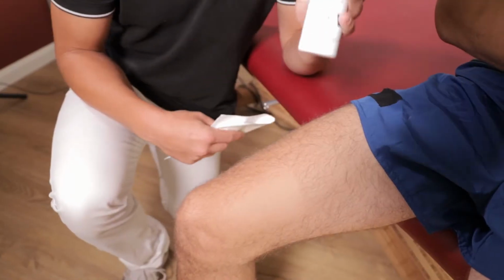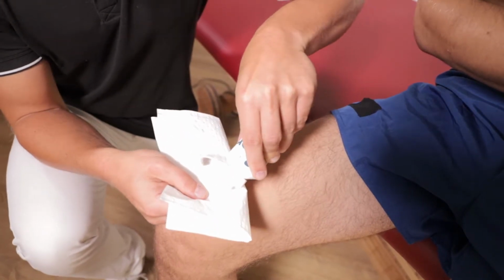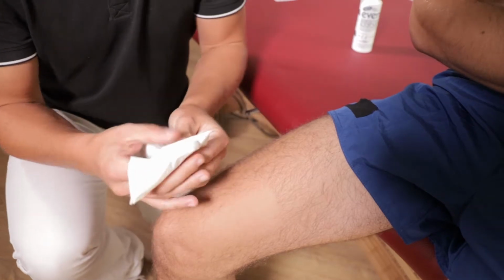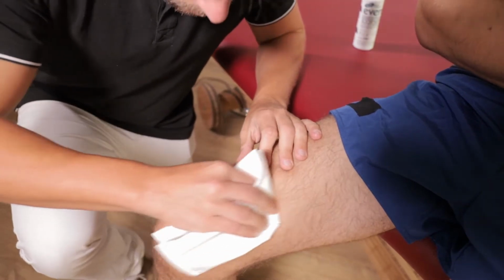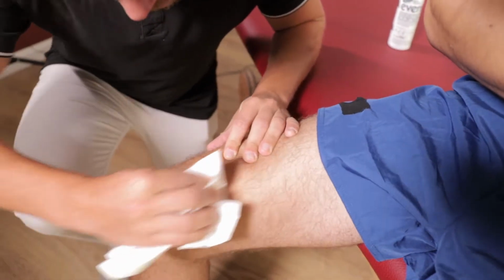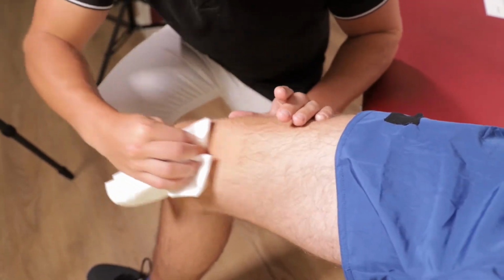For fast movements, special abrasive pastes can be used to remove dead skin epithelia, which produce the highest resistance, and cleanse the skin from dirt and sweat. Alternatively, very fine sandpaper can be used. Rub the skin with soft controlled pressure and clean it with alcohol.